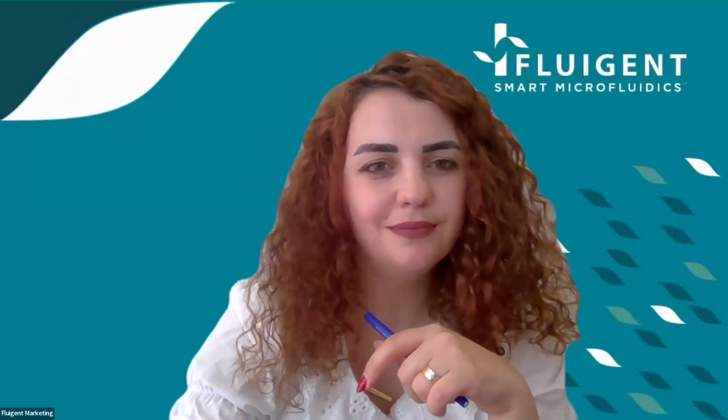And then in terms of the staining on the chamber, 37 for an hour seems to work pretty well. Yes. Any ways to reduce incubation time? So I assume you're talking about the staining of the antibodies. Heating, as we do to 37, I wouldn't go much above that. I think an hour at 37 is pretty good for me. I don't think we'd be doing more panels than that over a 24-hour period.